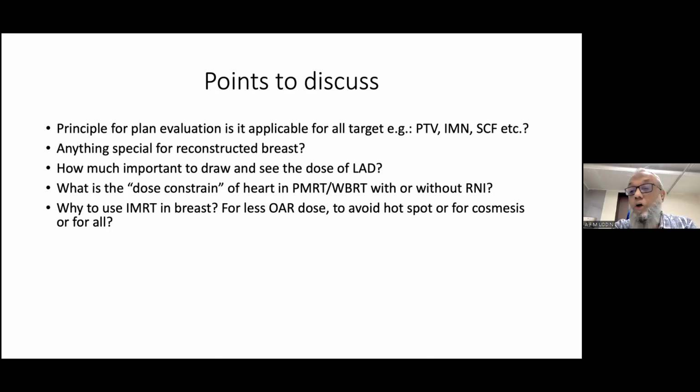Well, we need to make a call between our coverage and the patient volume, the technique, resource limitation. That is a different thing. So the next question from Arman was, is there any technique of drawing the volume when an oncoplastic breast surgery is done? When you do whole breast, we already discussed. Probably there is no special technique. We draw the whole volume. During evaluation, we may be a bit considerate to allow some of the area where we think that the normal breast tissue is not there.